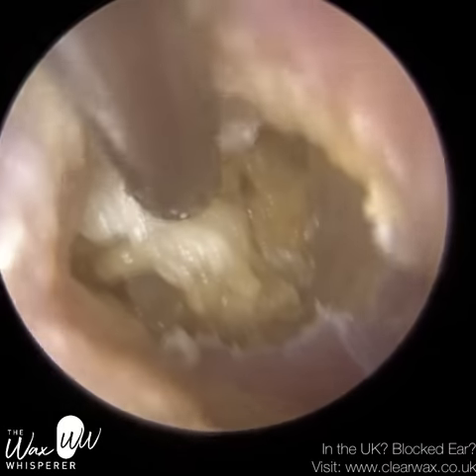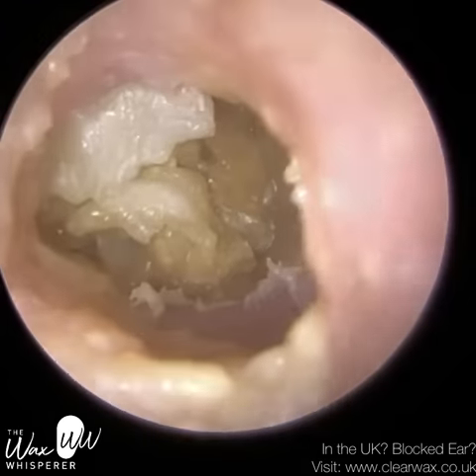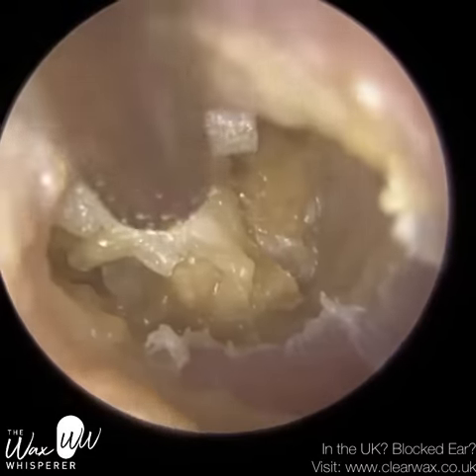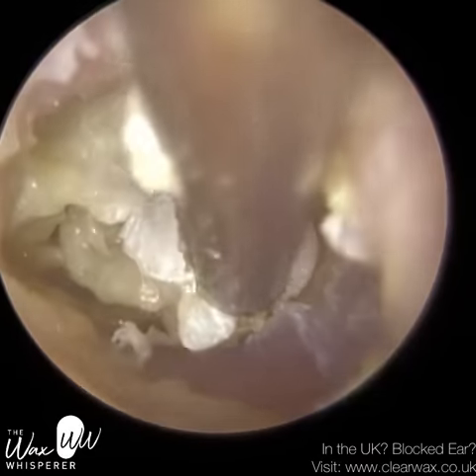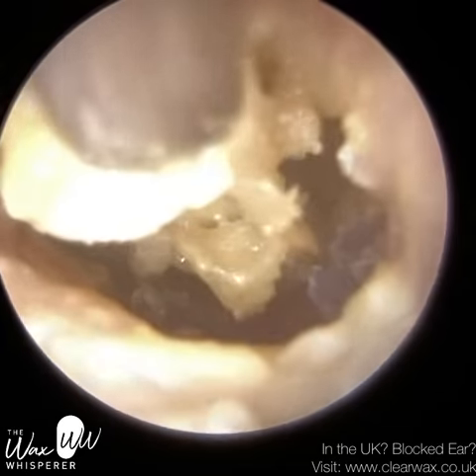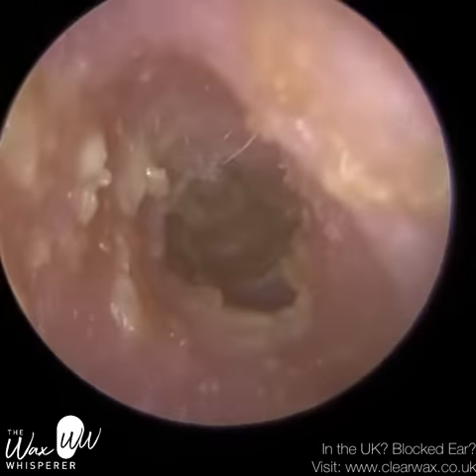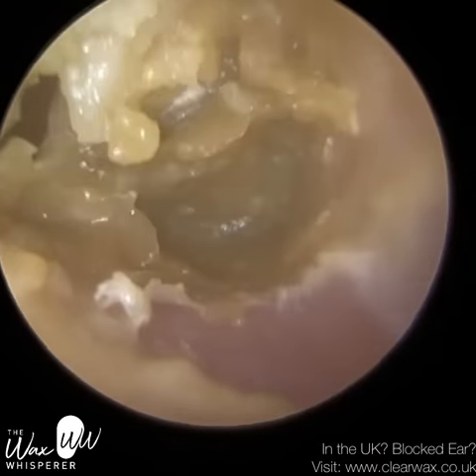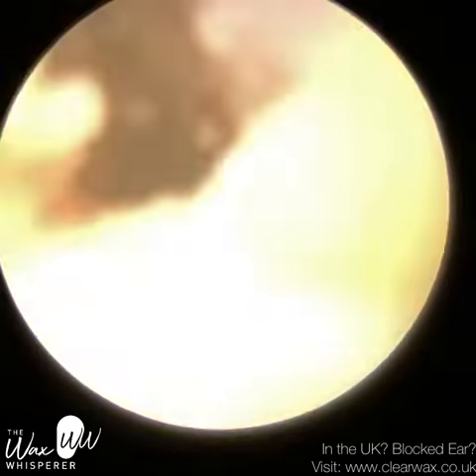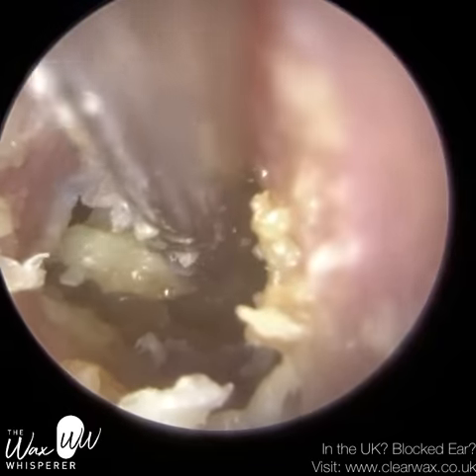So far I was quite pleased because it was coming out in big chunks, although there was quite a lot of debris and it was quite wet. Typically in the past it's been a real struggle because of the consistency. Once I removed this layer of dead skin, wax, and discharge, the consistency of the wax changed and it was very mushy. Just coming back to that collapsing of the canal — you may have just seen that the canal collapsed, which was what I was referring to.